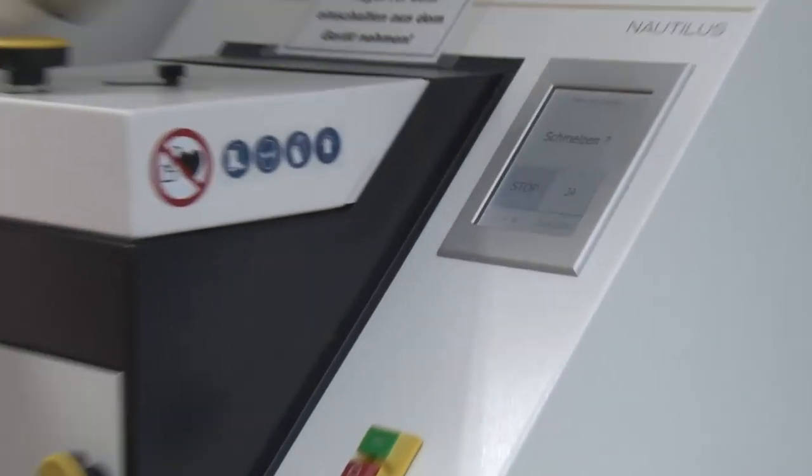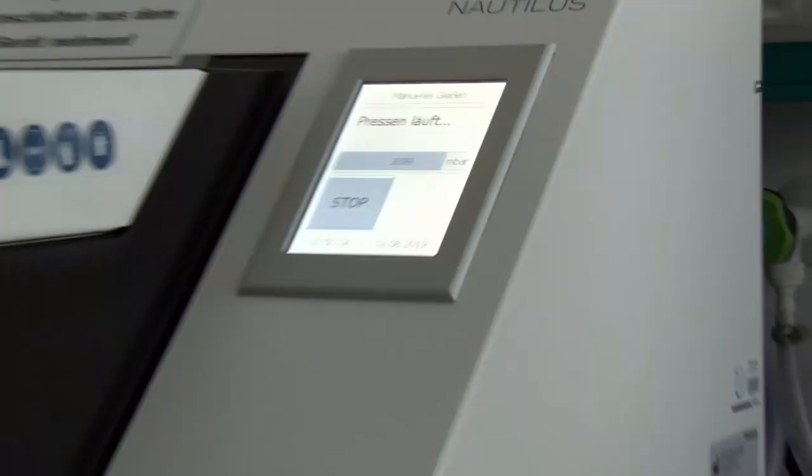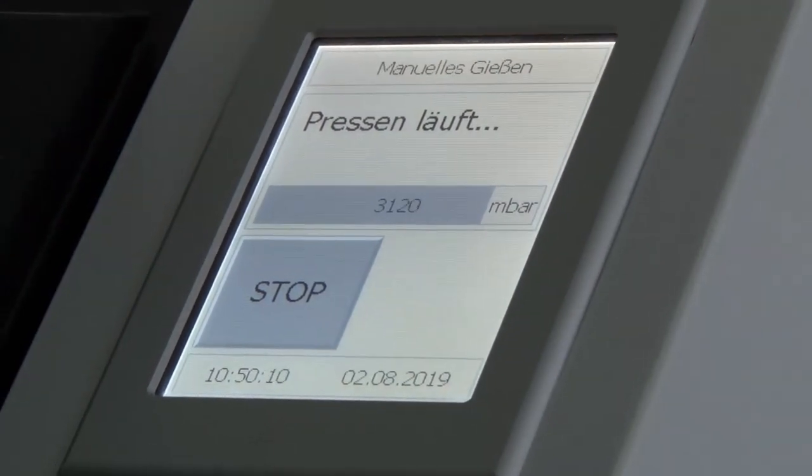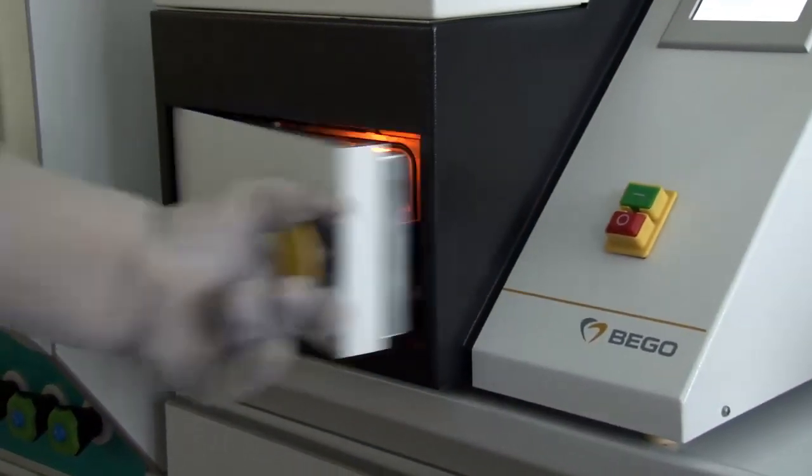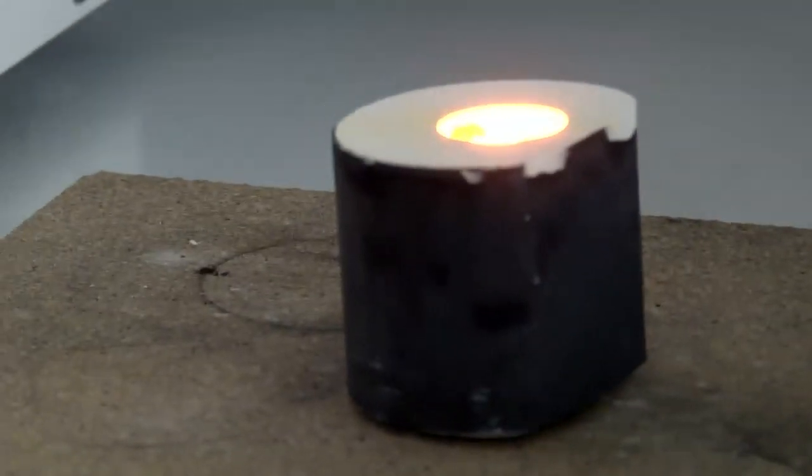It is then confirmed that the metal is now to be melted. Here the 4 metal cylinders are located in the crucible. They melt into one mass. Then the crucible divides and the metal flows into the muffle. Then pressure is applied to really press the metal into the smallest corners of the muffle. The muffle is removed and cools to room temperature.